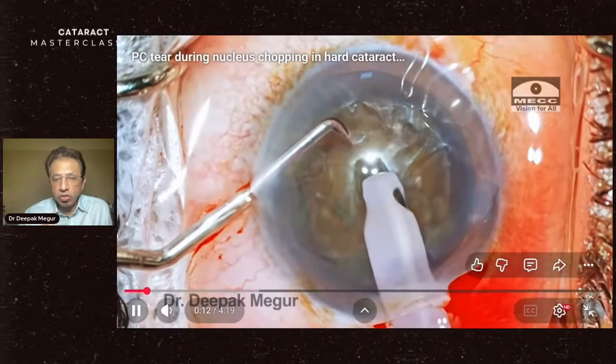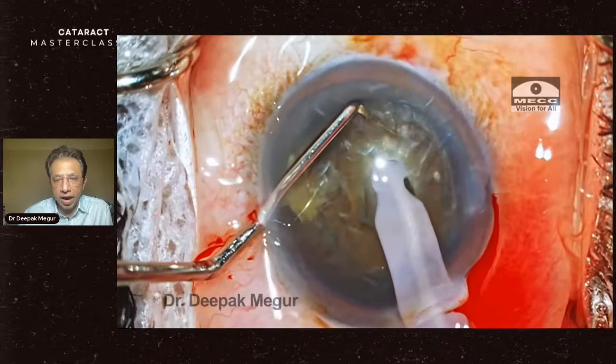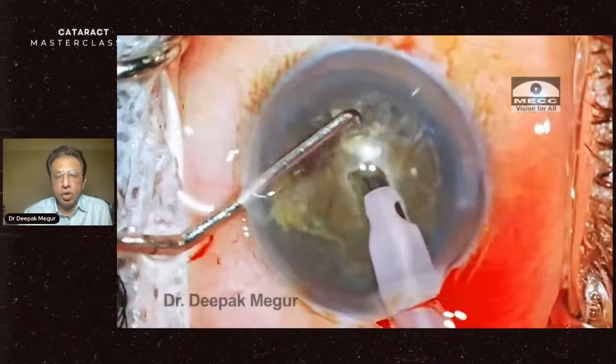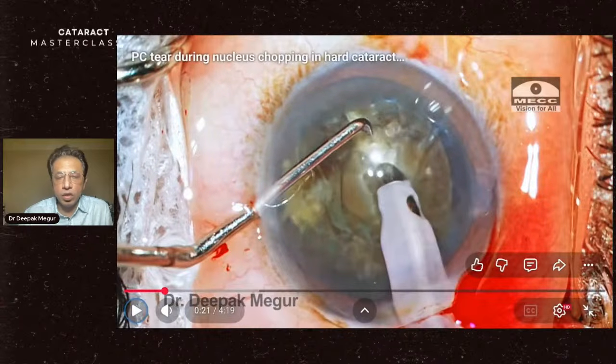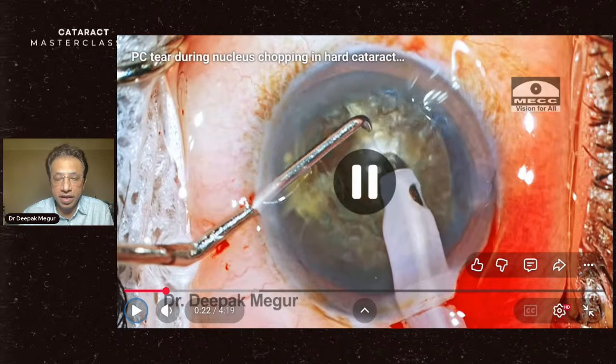Just observe here, the tip goes in. The burying seems to be all right, but the moment she does this, there's a torque. This is an ominous sign. When a nucleus of this density and size moves like this, it is an ominous sign. You have to take a pause, maybe think of some other technique.